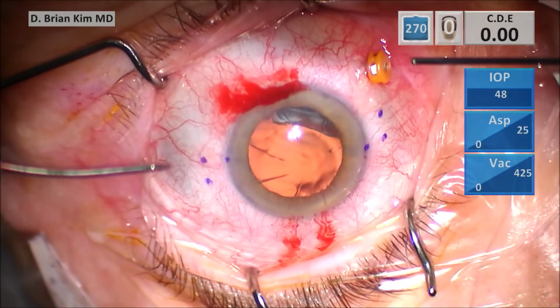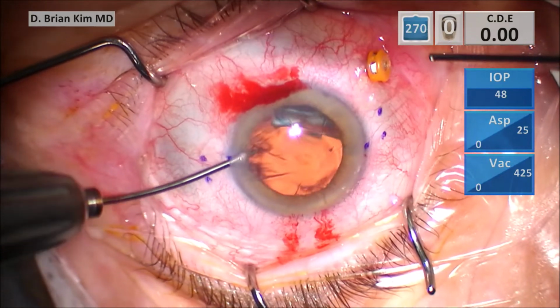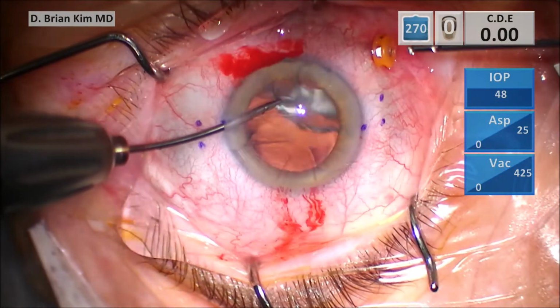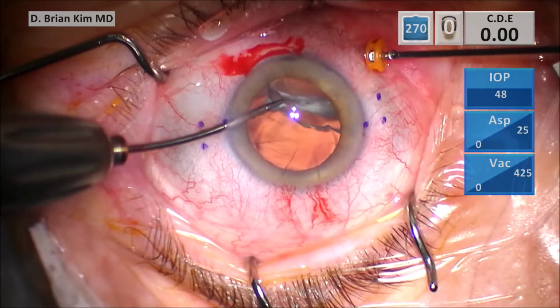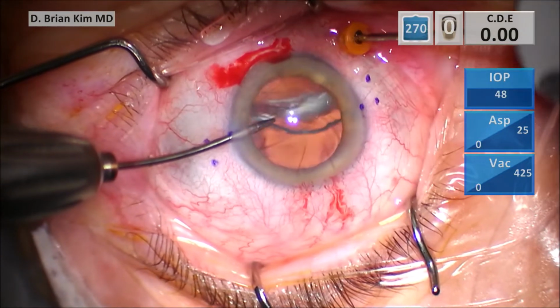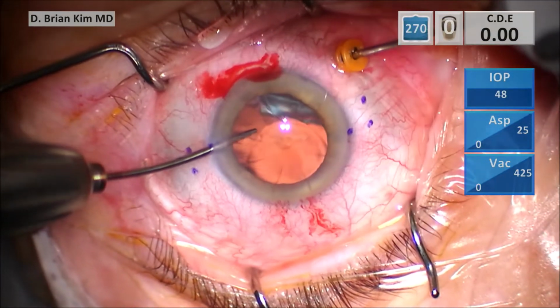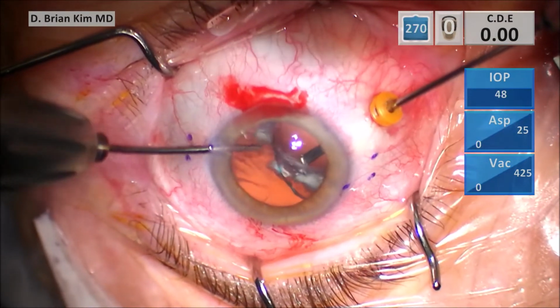Now, of course, the vitrector is tricky because it's straight and the nose is in the way. And so I'm going to go ahead and try to get to the lens. I know that trocar is in the correct position to be able to lift that lens up. There's no other way I could get to that lens. Trying to grab it from the main incision or some other incision would be completely futile. And so you want to lift it up. This is what I'm doing.